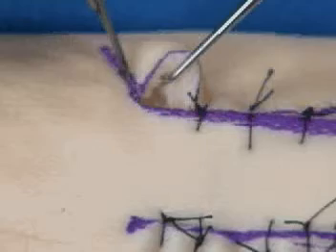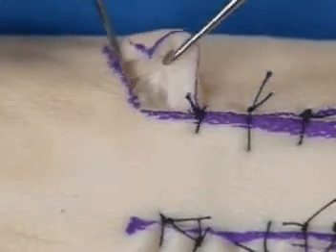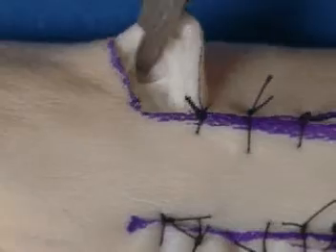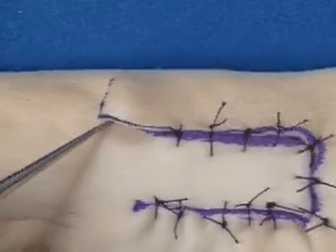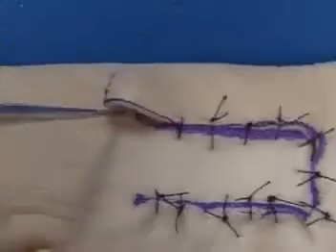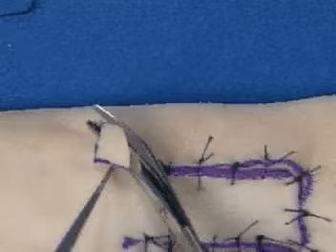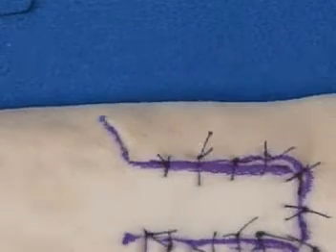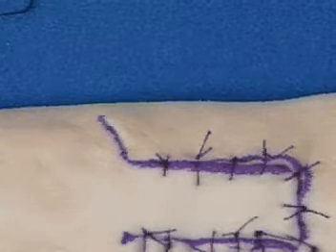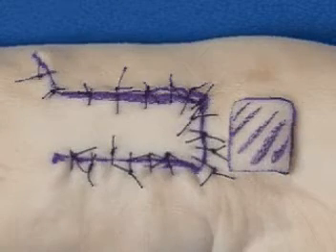It is then marked with a surgical marking pen. An incision is made perpendicular to the skin edge so that we can mark out the point of a triangle. Undermining is done under this dog ear deformity. The skin is transposed back until one can exactly see how much skin is needed to be trimmed. The skin is then trimmed and the flap is inset. This flap is then sutured into place and the dog ear deformity is resolved.